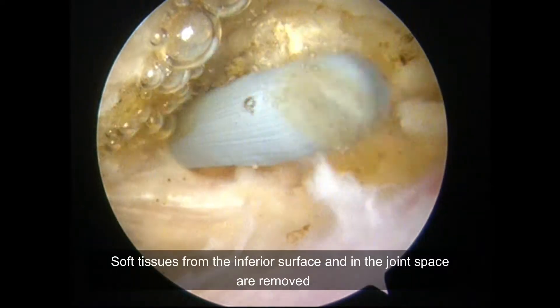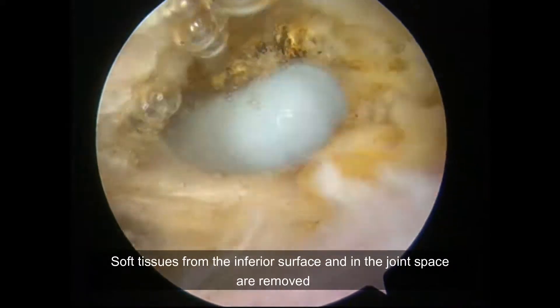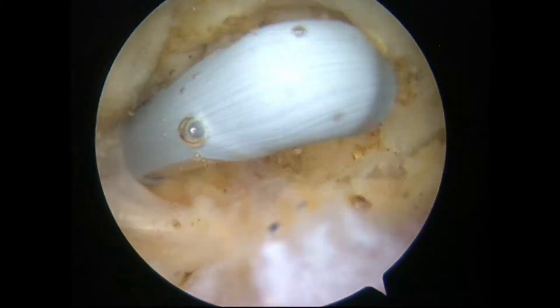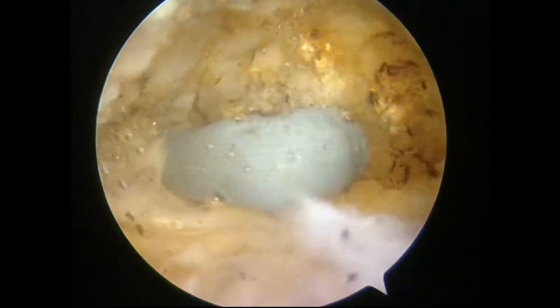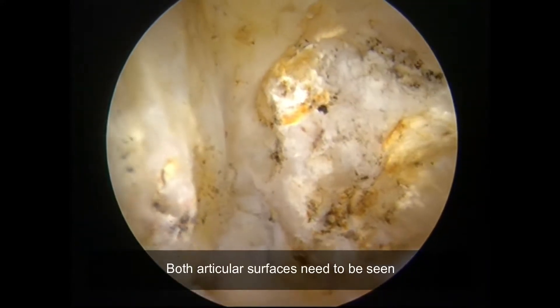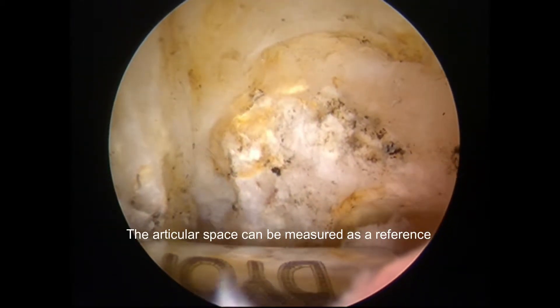Soft tissues from the inferior surface and within the joint space are removed. Both articular surfaces need to be clearly visualized. The articular space can then be measured as a reference for the planned resection.